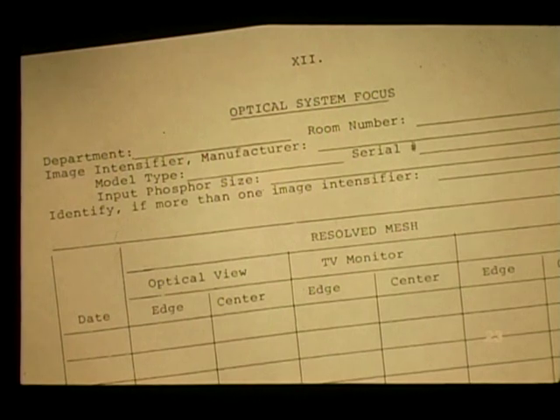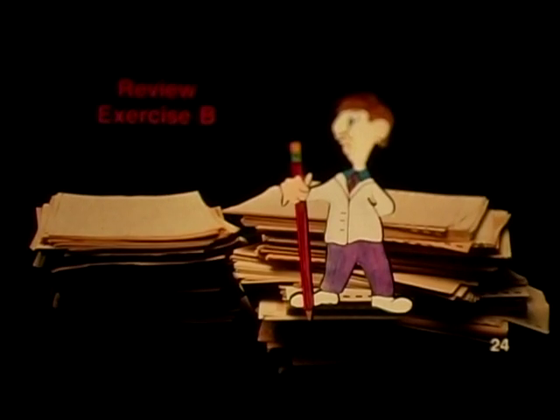The test film should be filed for future reference. They can provide a useful point of comparison with future tests.